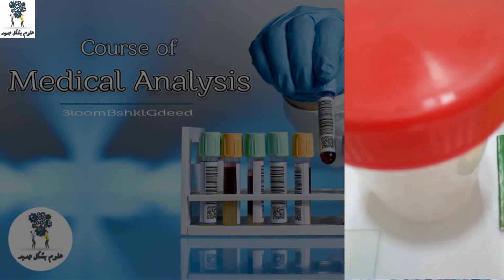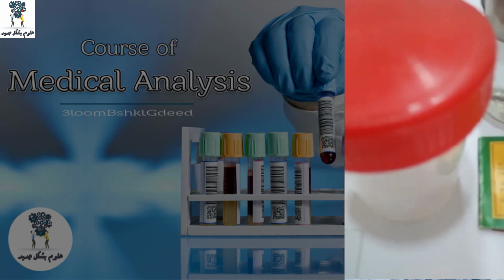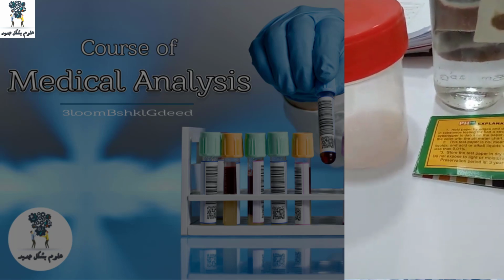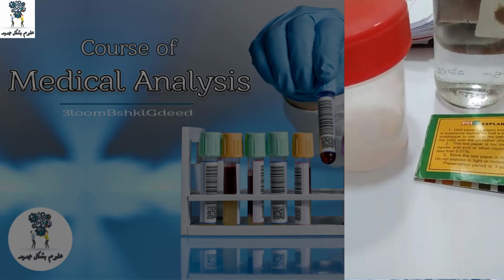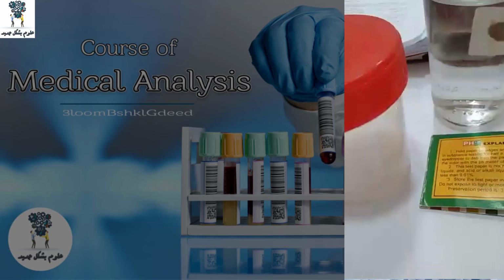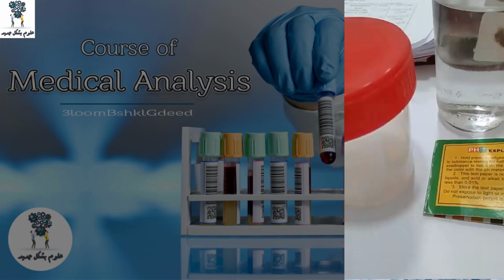Or there is 1 sperm, so you will multiply it by 10,000. Or there are 4 or 5 sperms, so you will treat it as normal sperms, and you will make the normal dilution. So it is the first case.